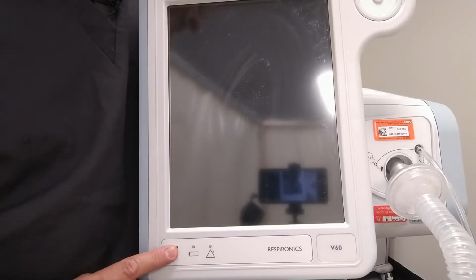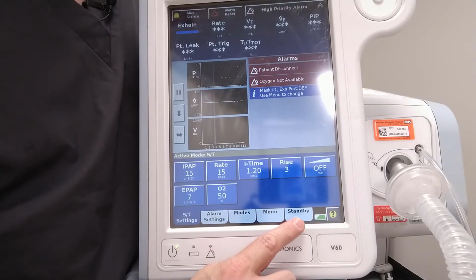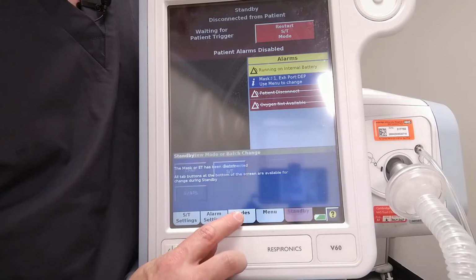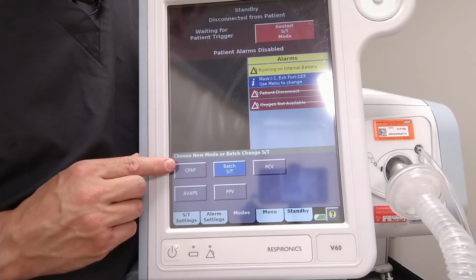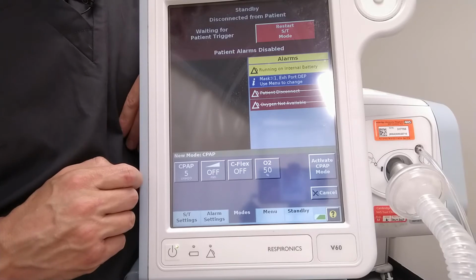When you turn the V60 on, it'll start working straight away using the settings it was in the last time it was used. You can temporarily stop it by pressing standby. Then, to put it into CPAP mode, press Modes and select CPAP. If it's already in CPAP mode, this button will be blue and it'll have "Active" written above it. That takes you to the CPAP settings screen.